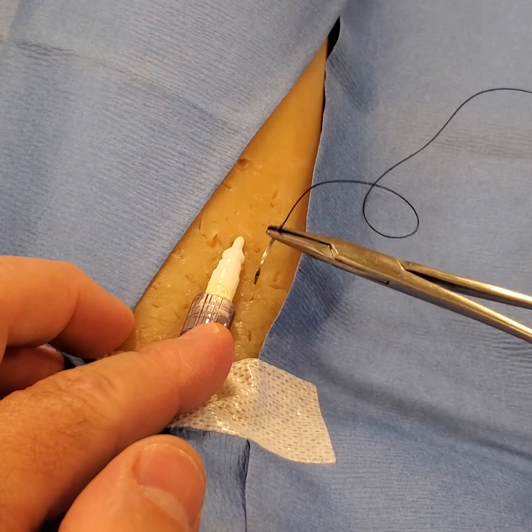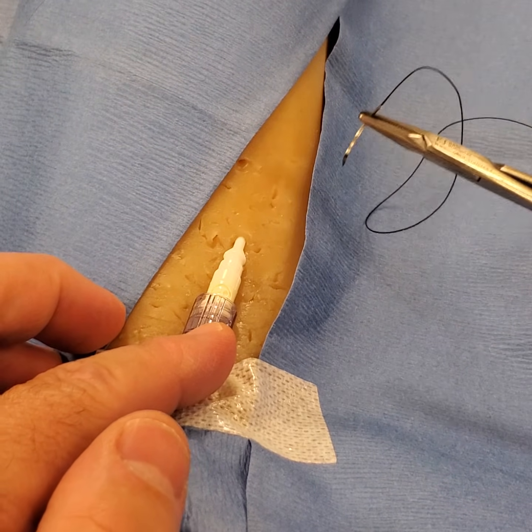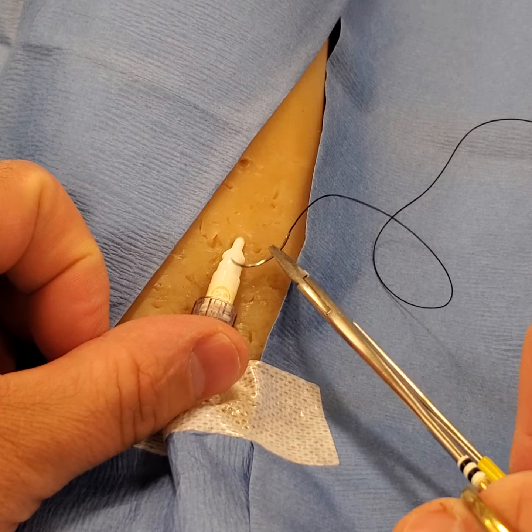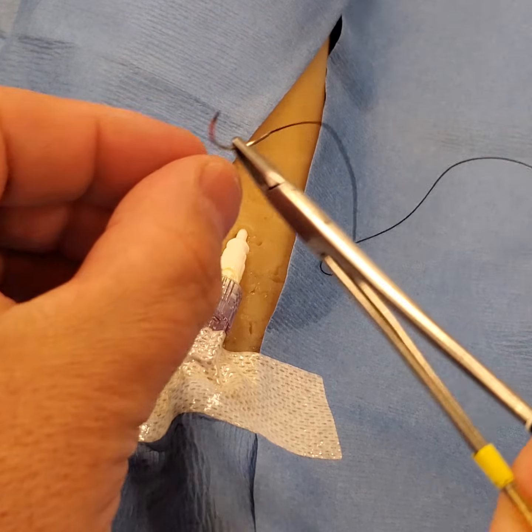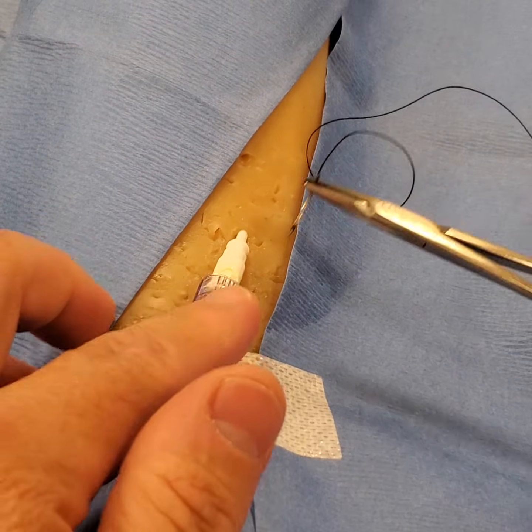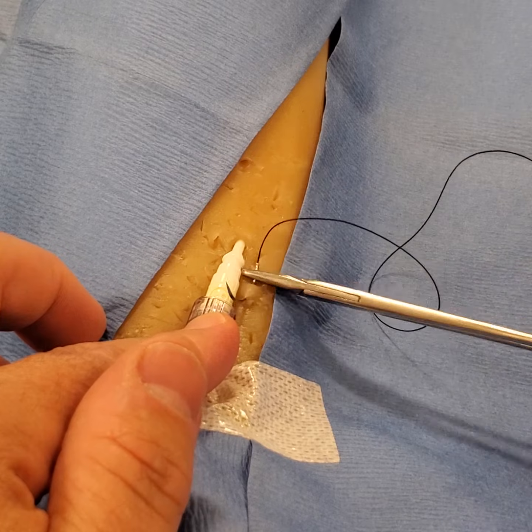Being right-handed, I will create an anchor point on the right side of the catheter. If you're left-handed, it may be easier to do it on the left side. These catheters have a groove which was meant for a separate attachment apparatus to create flanges, but usually they don't come with one when they come out of the operating room. So we'll start by creating an anchor point on one side.